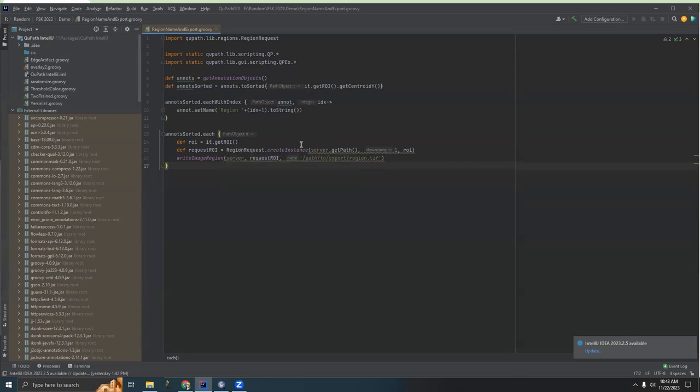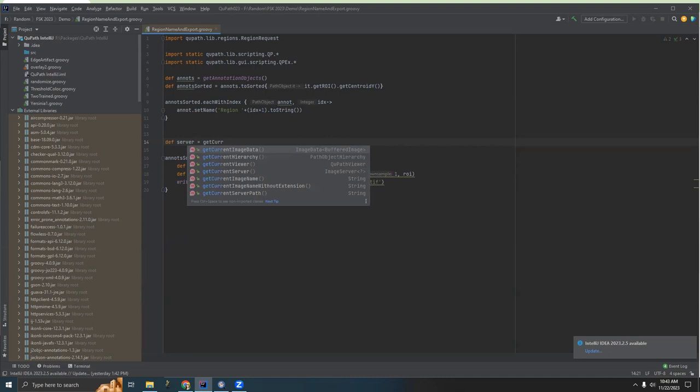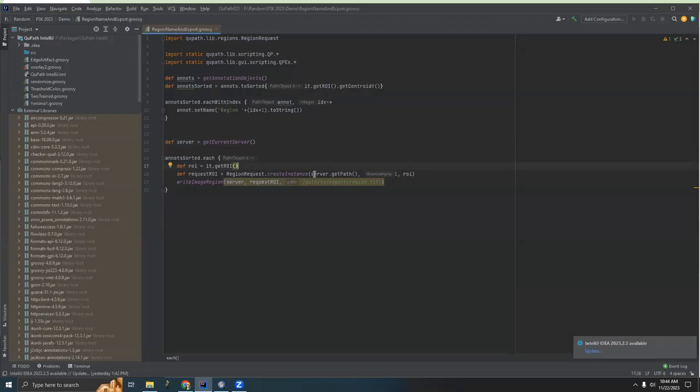So we're generally making a region request. We're creating a specific instance of that request. It wants to find the server. We haven't defined that yet, so I'm gonna define it right here. And that's just going to be server equals get current. In the read the docs that had just been up at the very first line in this box. So if you can't remember where that comes from, it's always great to check read the docs. So it doesn't actually want the server, it wants the path, but that's fine. It'll just figure that out.